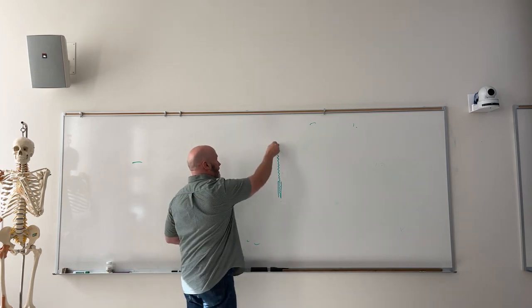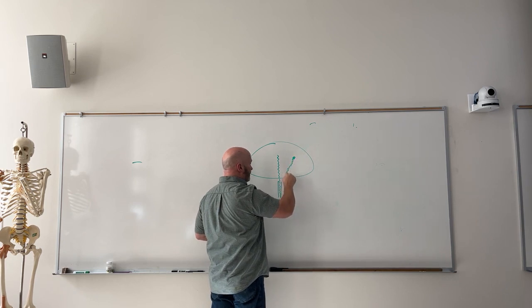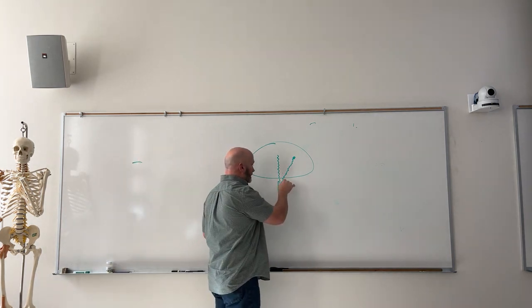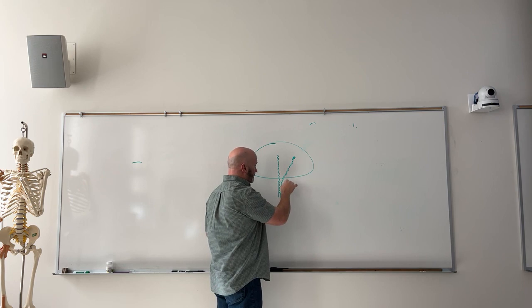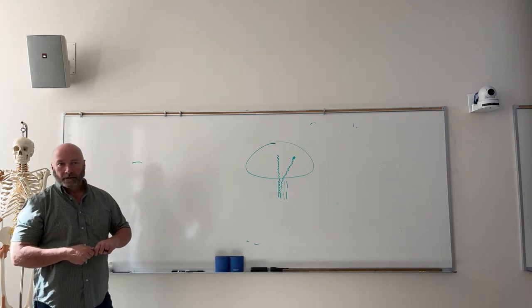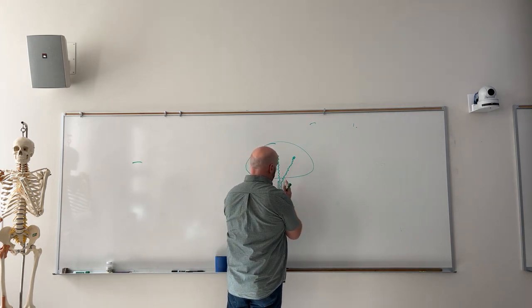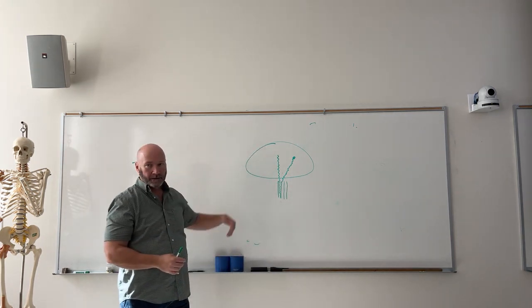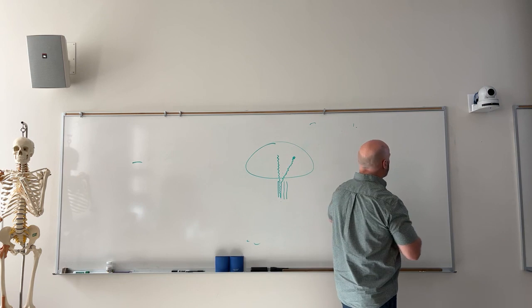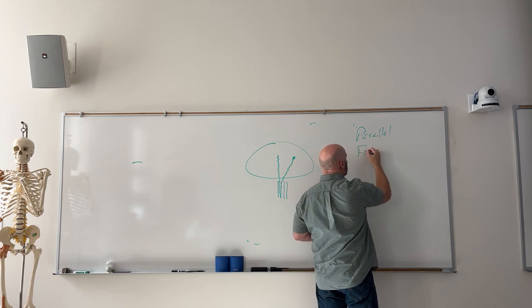All right, so we got scattered X-rays. That will be a transmitted X-ray. We got a scatter X-ray created here, and if it is traveling on a trajectory like that, then our next interspace would be here. Would that X-ray photon make it through the grid? The answer is no. Okay, so first off, we have to have the grid strips parallel to each other and parallel to the central ray. We have really fundamentally two types of grids. One is parallel, and one is what we call focused.